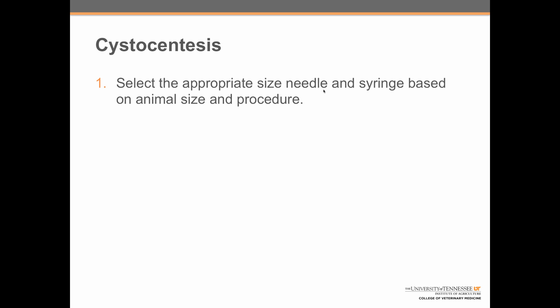The first step is to select the appropriate size needle and syringe based on the animal size and the samples needed. The second step is to aspirate the syringe to break the seal on the syringe and also break the seal on the cap.